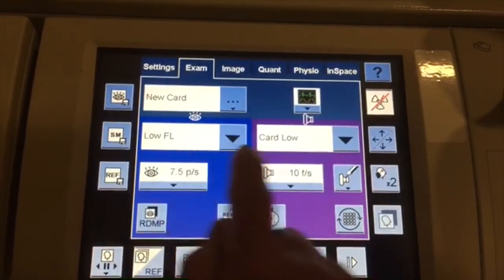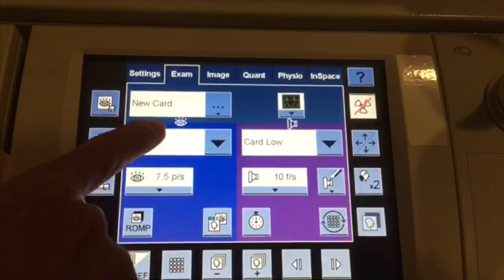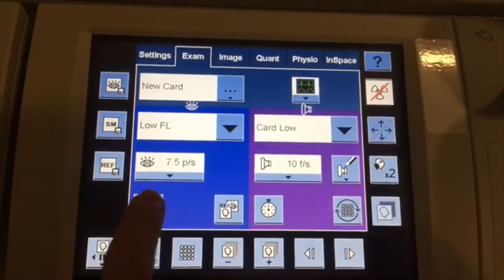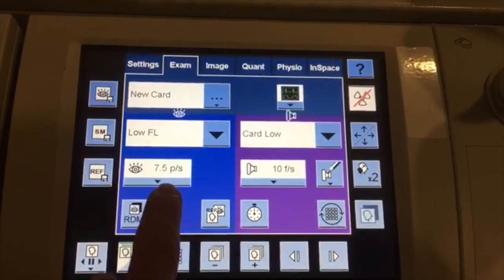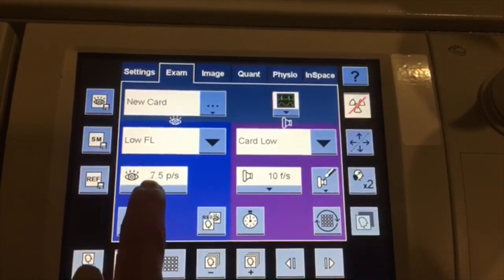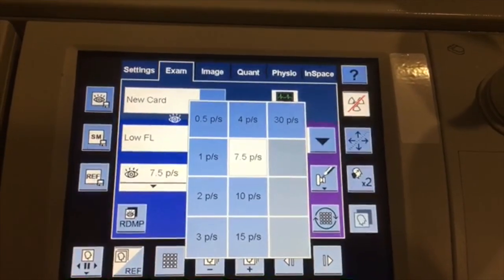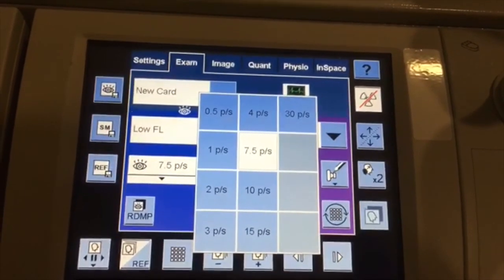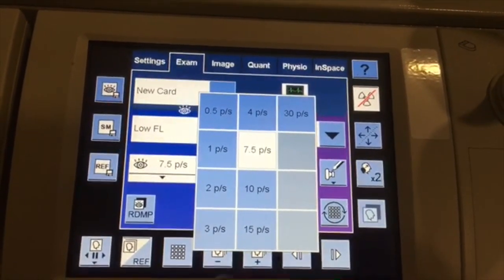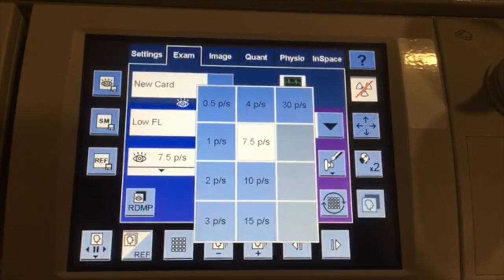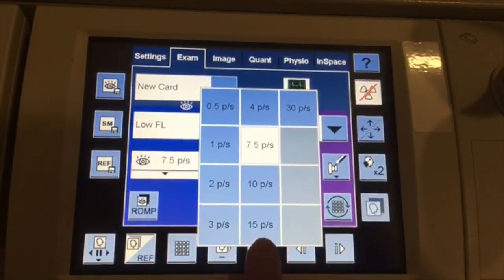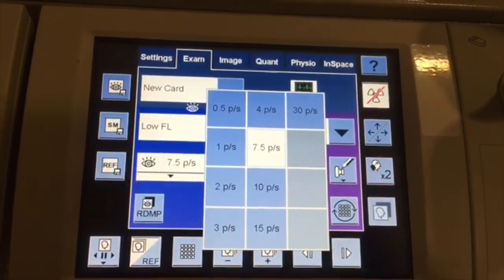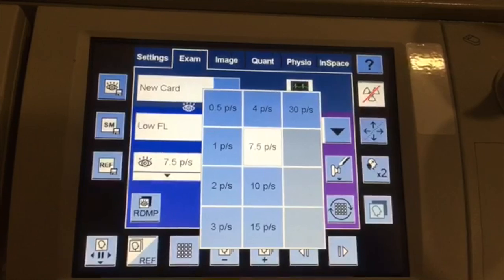Right here we have low fluoro and cardiac low. All of this with the eye icon is basically for fluoroscopy. As you can see, you have 7.5 on the pulse sequence for fluoroscopy. You can actually open up this module and drop down your pulse sequences. By doing that, you're able to change the dose to the patient. If you go from 15 pulses per second to 7.5 pulses per second, you'd actually be dropping your radiation dose by 50%.